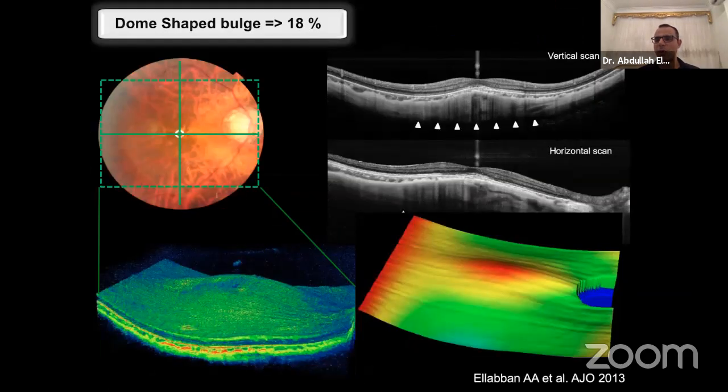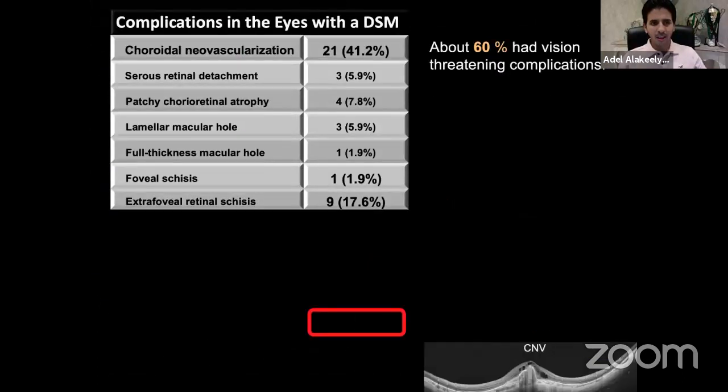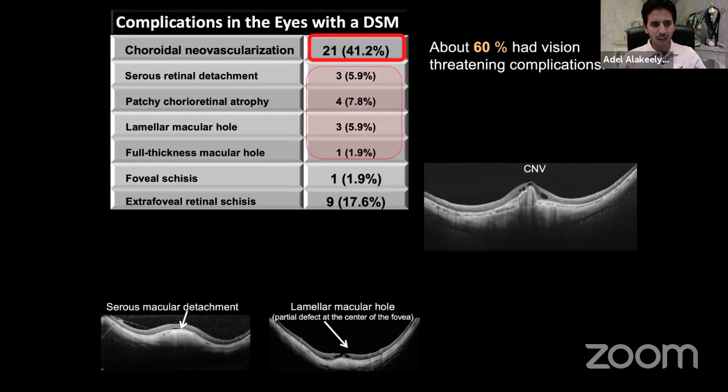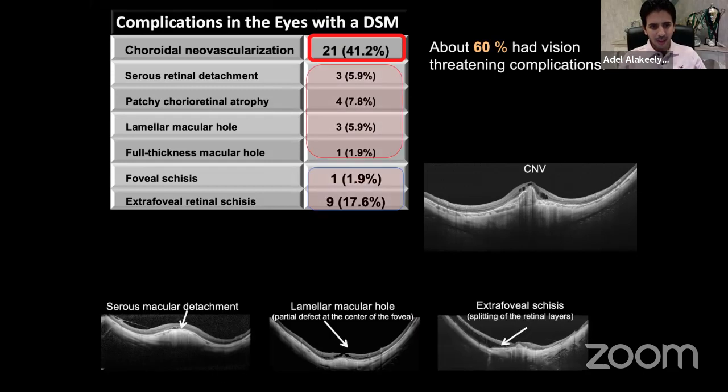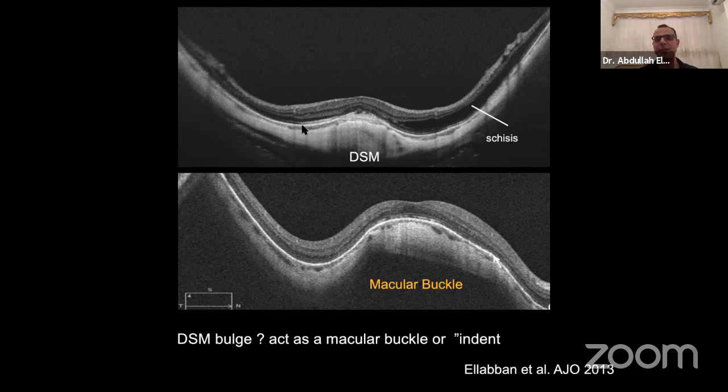What was the second question for Dr. Sousan? So you think it's a predictor for a large myopic progression in the future, if it appears in an early age? Honestly, I don't know, but it's an interesting finding.